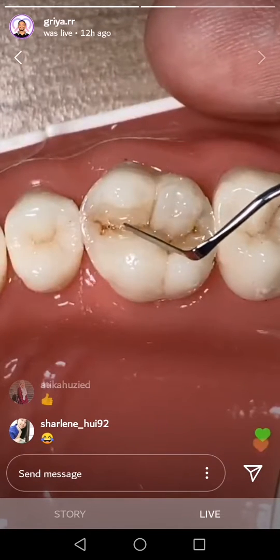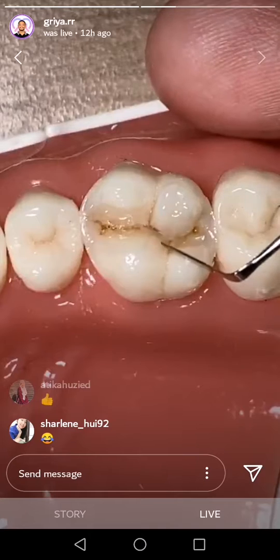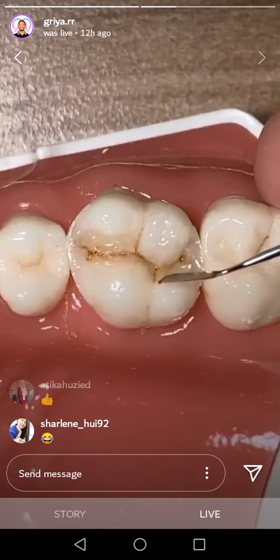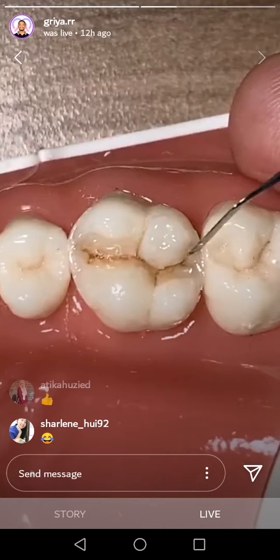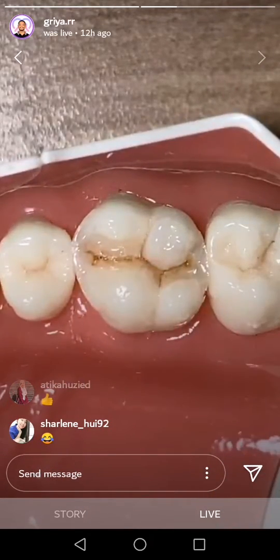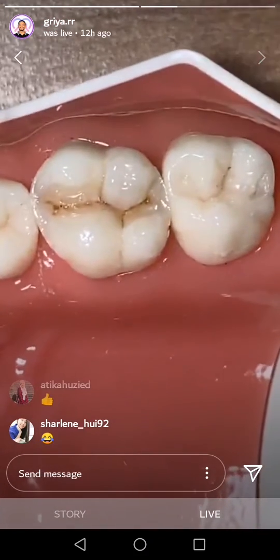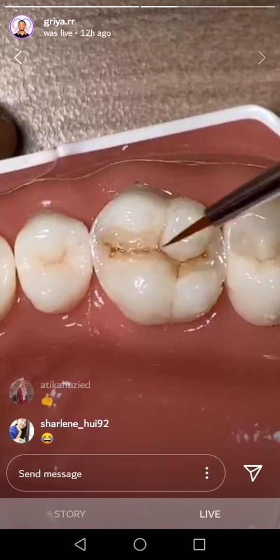Okay. Like this, follow the line. Okay. And then this one. Okay, then this one. Okay, you can see the line is already good, but they are still bulky. They are still high. Oh, so you need to make sure.